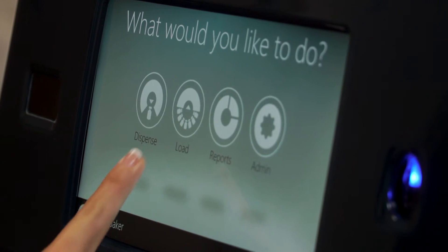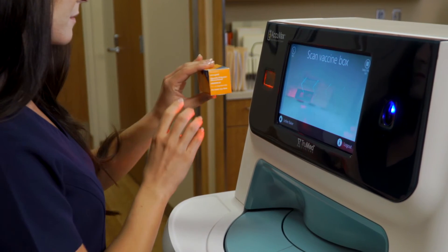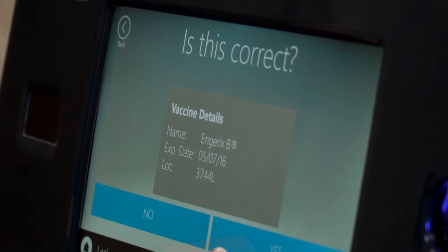Next, select the load icon on the intuitive touch screen display. Hold the vaccine's barcode up to Acuvax's scanner and within seconds, Acuvax recognizes the type of vaccine being loaded.